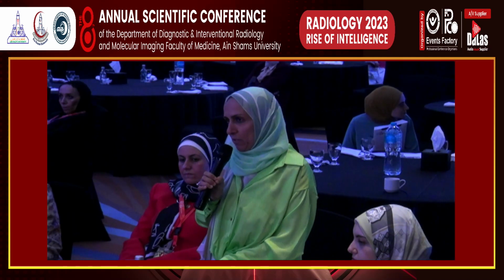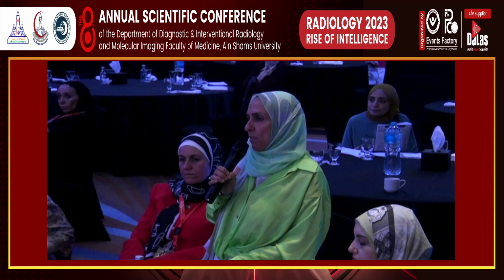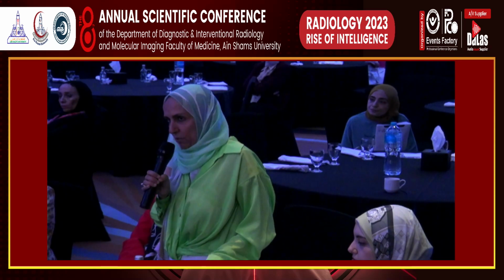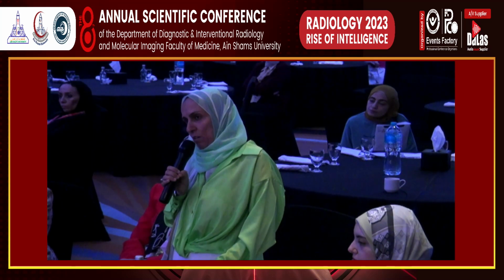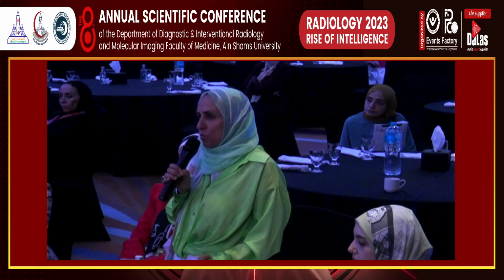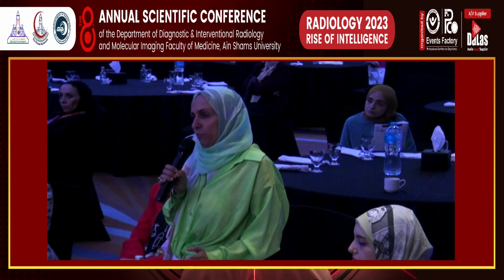إحنا في الدمرداش يعني we rely on 3 تسلا لأن هو it is the best recommendation. بس in case إن الماشين فيه يعني it's not working برضو we do not cancel. ممكن to rely on 1.5 تسلا لأن actually إحنا عملنا حالات في الأول بالـ1.5 تسلا it is recommended إن الحالات تتعمل على 2 machines ونتأكد إن البروتوكول is optimized في 2 machines.